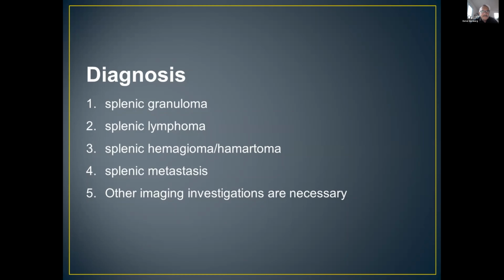Another question that could be put was if the splenic lesion was a primary tumor, but the contrast enhanced behavior was of a benign lesion. But my question is, have you ever seen a primary spleen carcinoma, a malignant tumor? I haven't seen that.